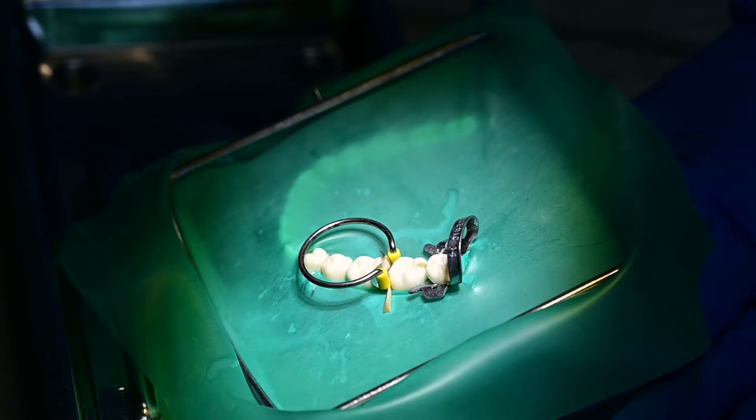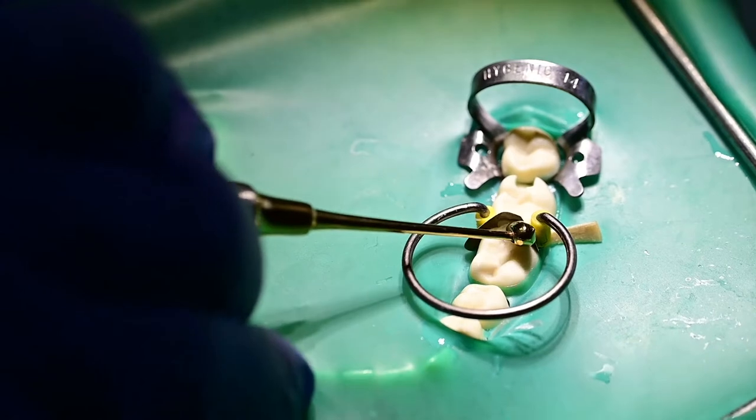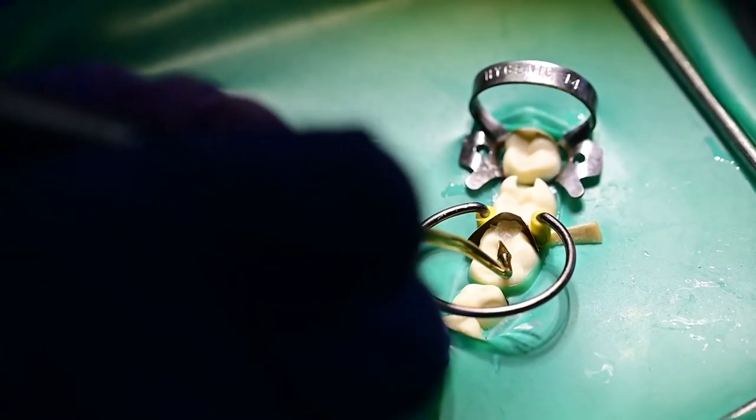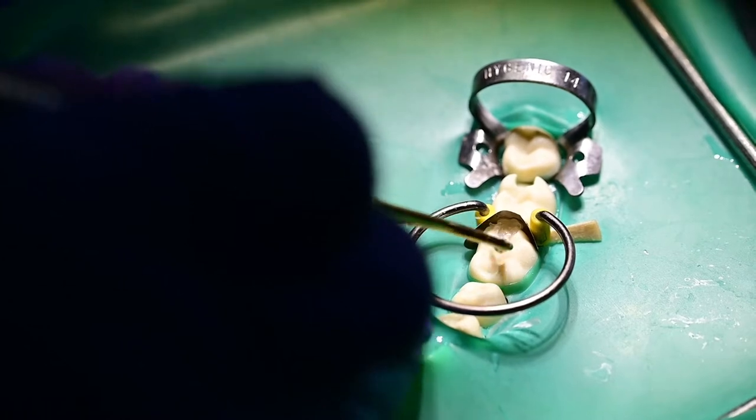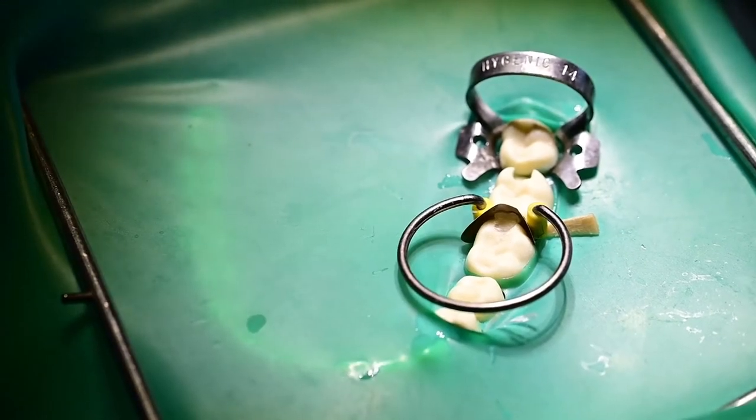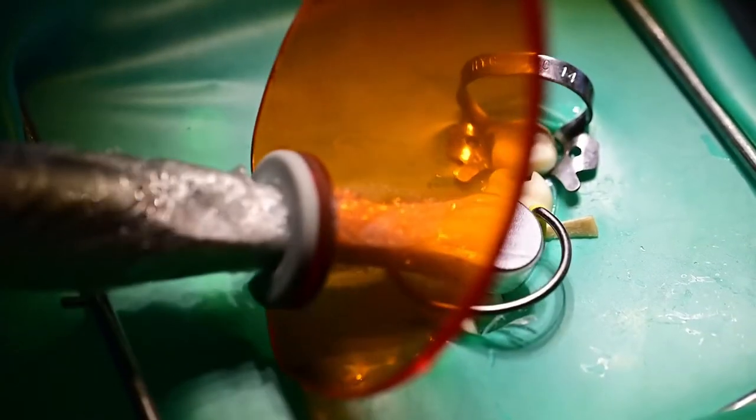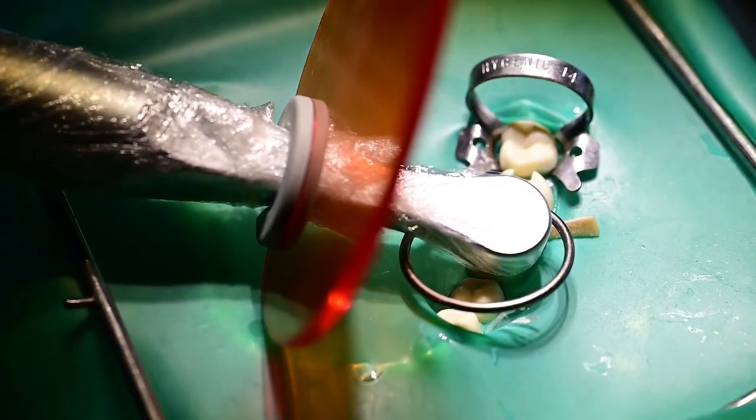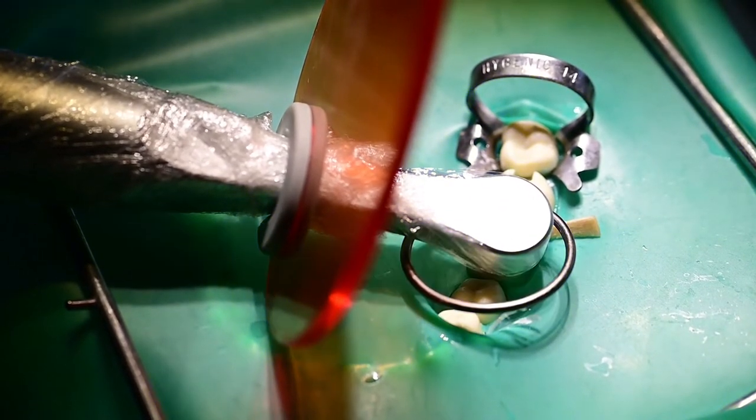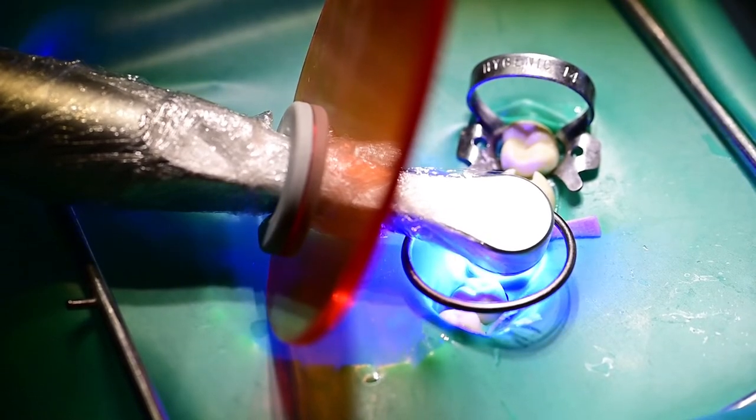I now add the last layer of material. Concentration of this training is not so much of the restorative part. I just wanted to illustrate the material manipulation aspect. My final curing, 20 seconds. Pulse delay. It is one of the strategies of controlling polymerization shrinkage stress.